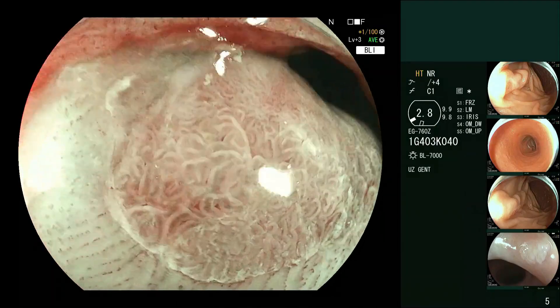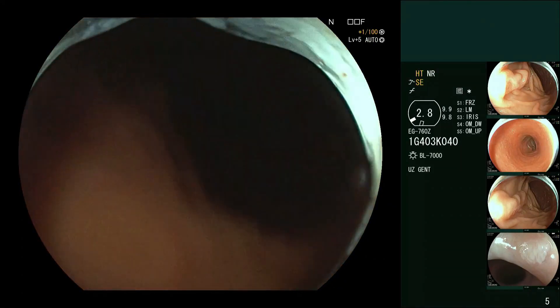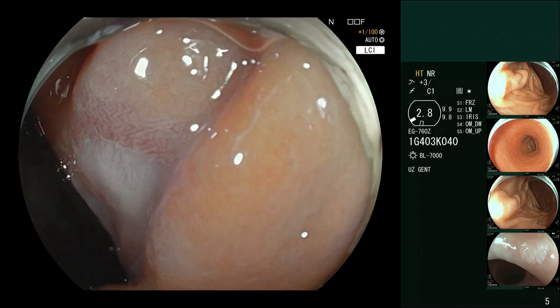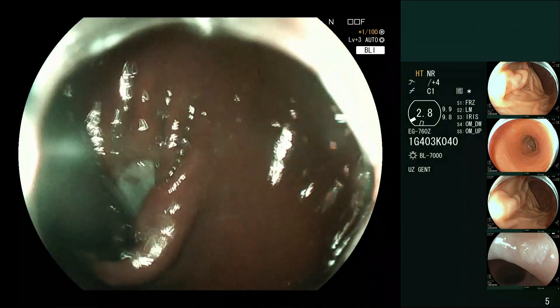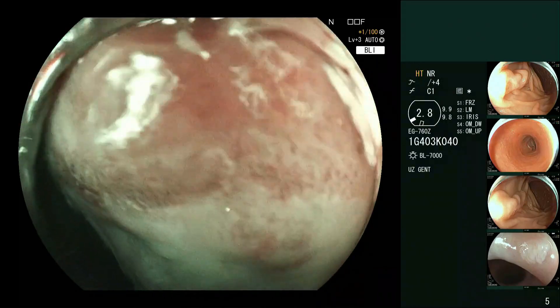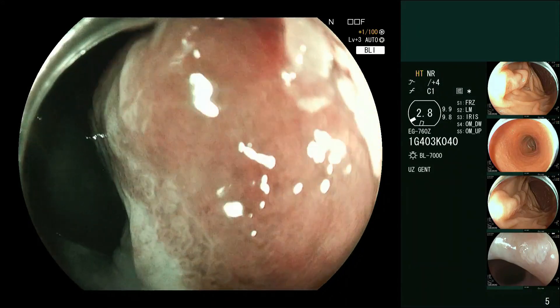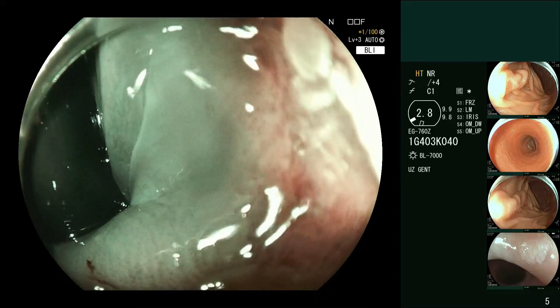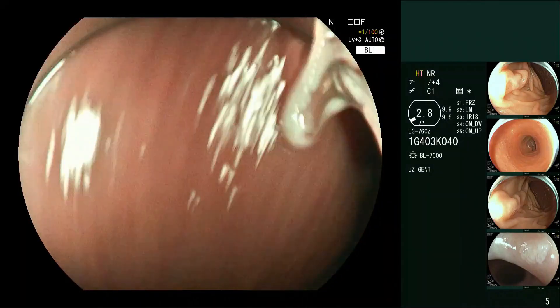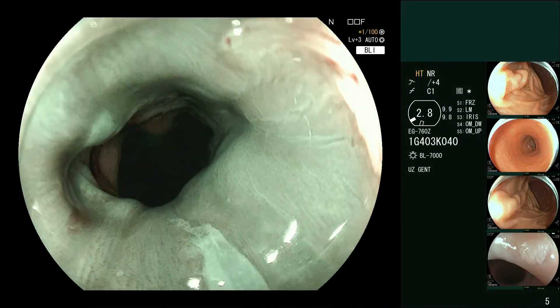Retroflexion is also a good way of analyzing the gastroesophageal junction, which you should do in all cases. With an endoscope like this one that has an excellent tip bend, you can get right in there and do the same thing from below. If the patient is nicely sedated, you have a very nice ability to get right up in there. By flipping the scope 360 degrees, we can get nice views all the way around in retroflexion. Most people using virtual chromoendoscopy for esophageal pathology detection use it on withdrawal.